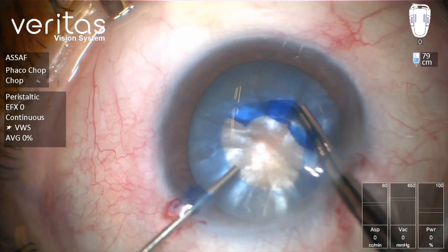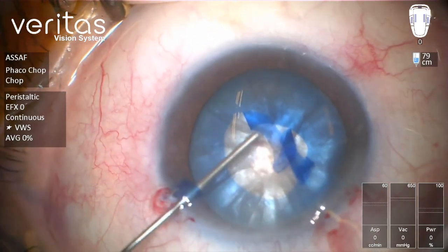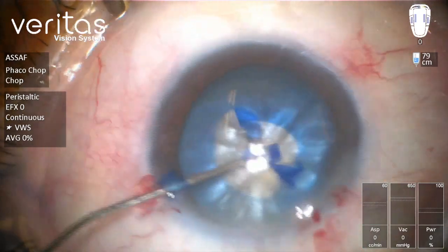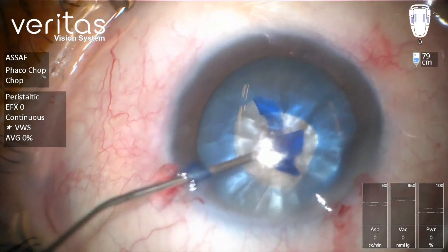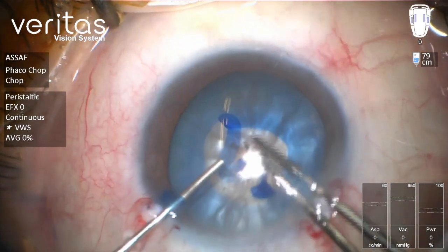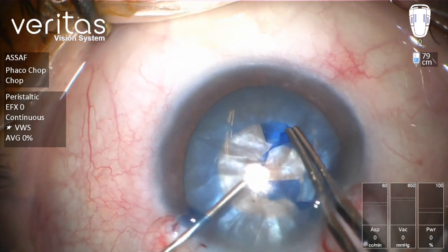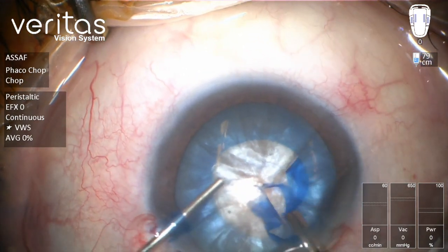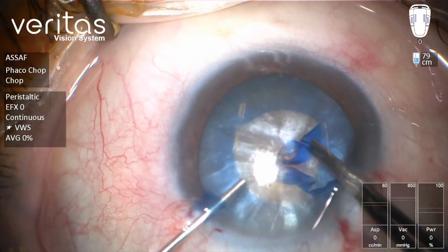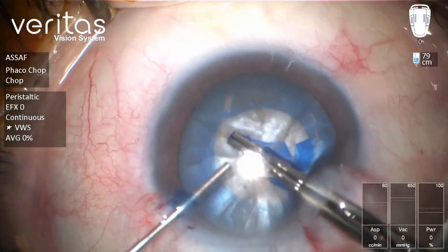As you can see, I'm keeping the OVD cannula in my left hand ready to inject OVD whenever necessary. I'm trying to keep the flap in the center part of the anterior chamber and continue rhexis formation. Again, I'm going to direct this flap toward the center.